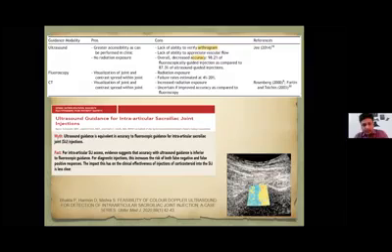Okay. So a little bit about the benefits and the drawbacks of ultrasound and fluoroscopy. With ultrasound, it is portable, easy to use, and greatly accessible. There is no ionizing radiation. These are the usual advantages that we have.